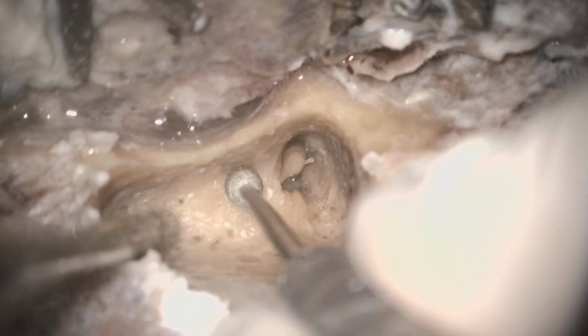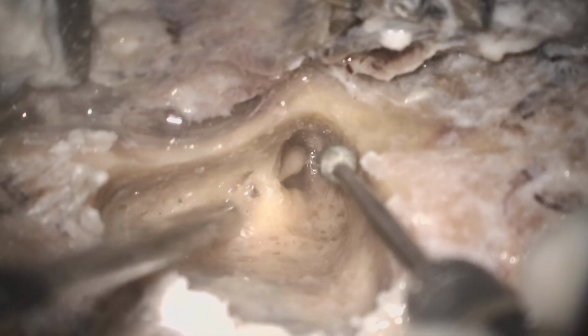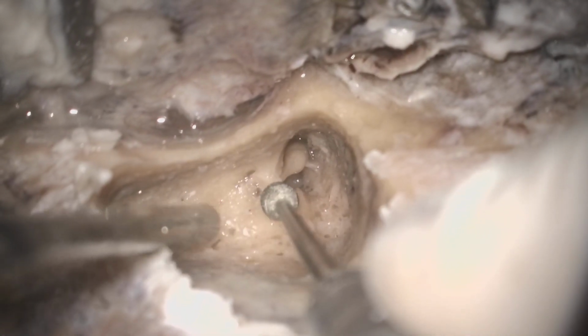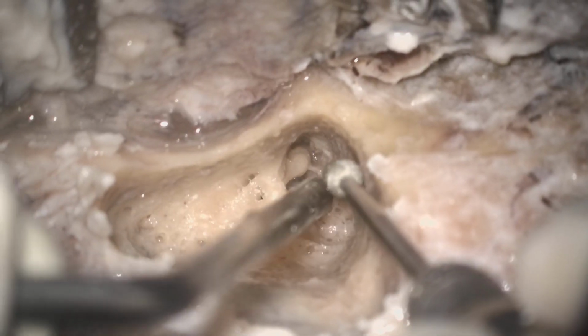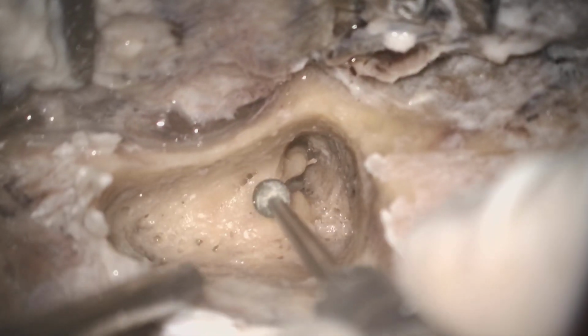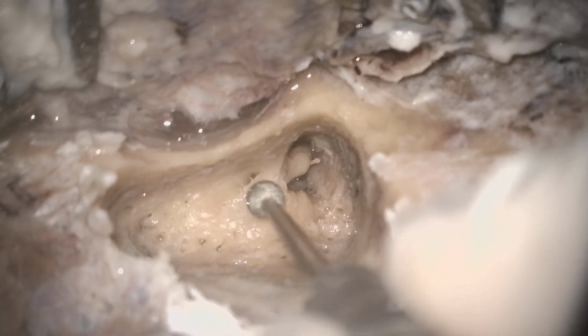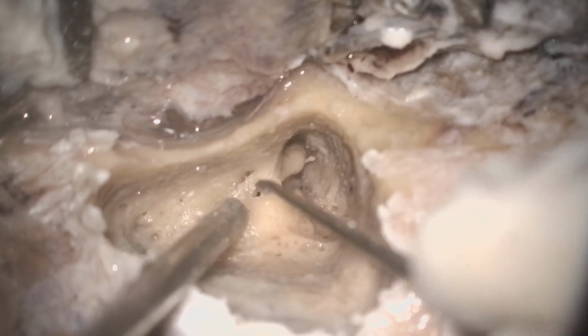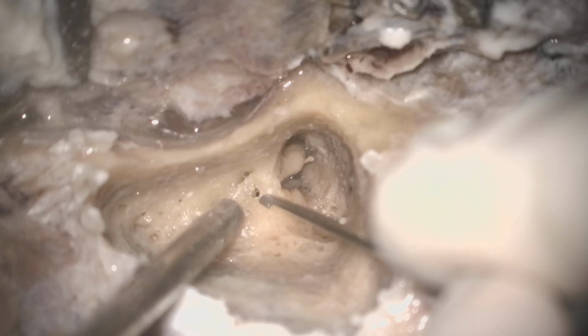Now here you will find the chorda tympani. Don't worry, give water. This is where the facial nerve will be. So this triangular space is the posterior tympanotomy. Whenever you are trying to go for posterior tympanotomy, always start from the superior part, very near to the lateral semicircular canal, because this is the base of the triangle. So the dimension is maximum at that area.